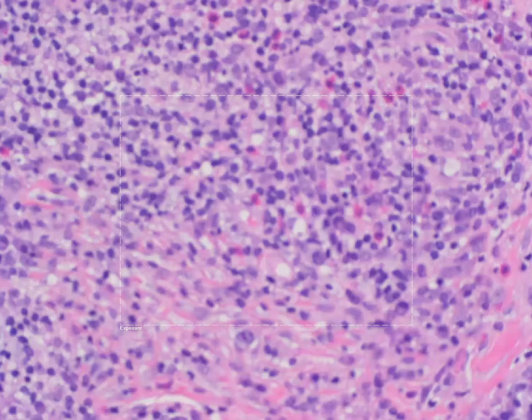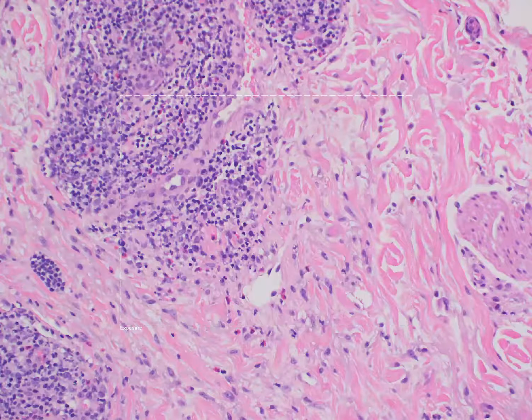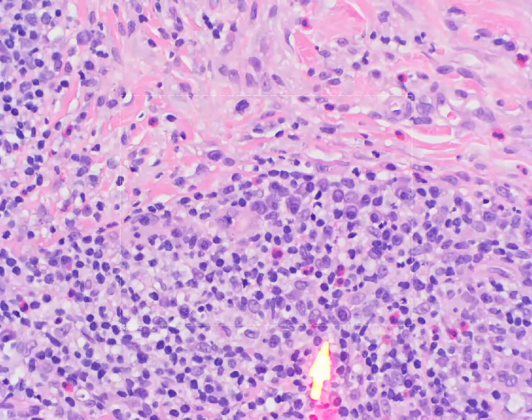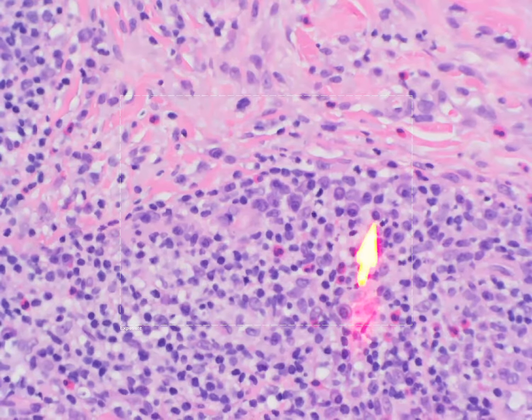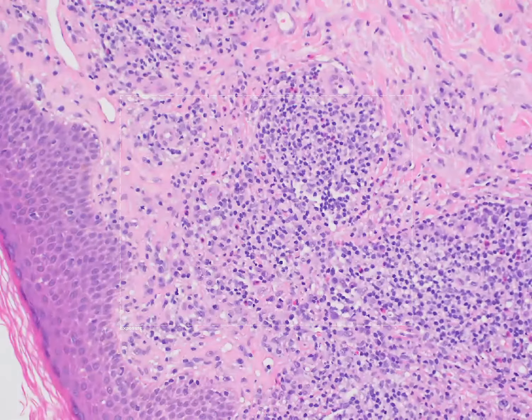Hopefully you can appreciate the bright red cells with granules in their cytoplasm, so lots of eosinophils in the background. So this pattern is perivascular, interstitial, lymphohistiocytic with eosinophils. And by the way, there are also plasma cells in here. I'd love to point those out. These are plasma cells, which is typical for an insect bite-like reaction. So this is a hypersensitivity reaction of the body to the mite, to the scabies infestation in this person.